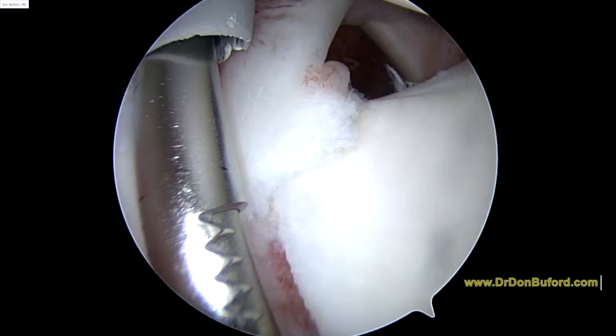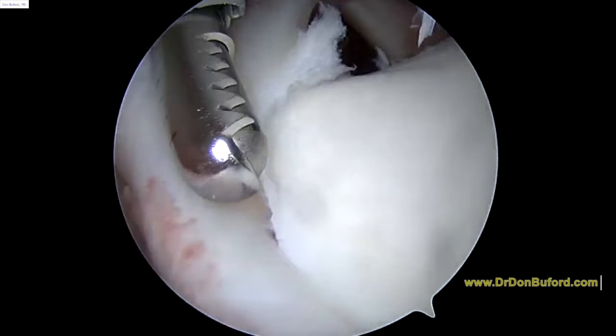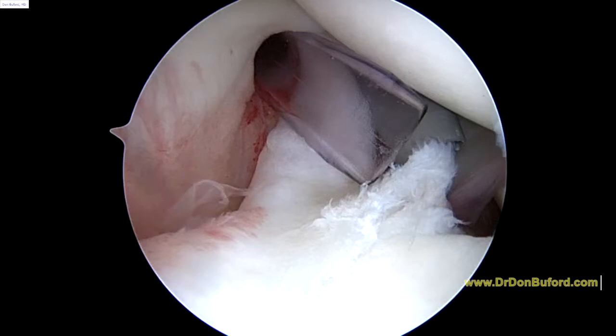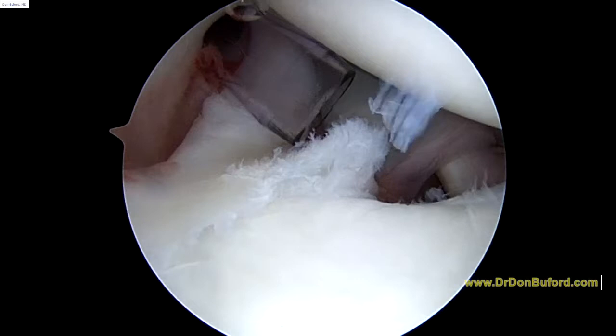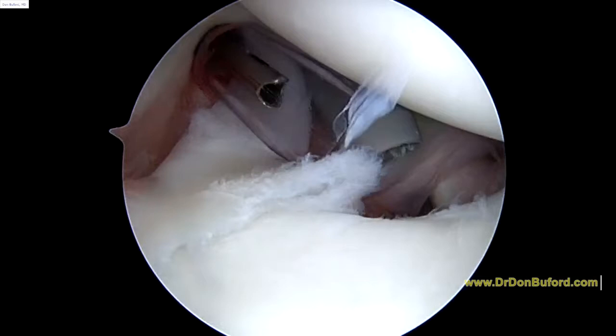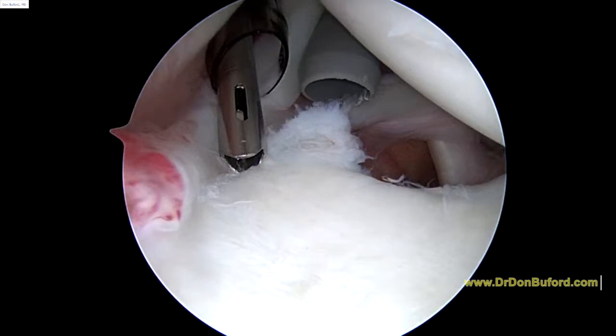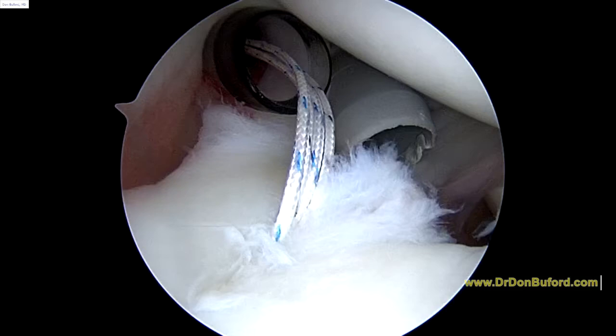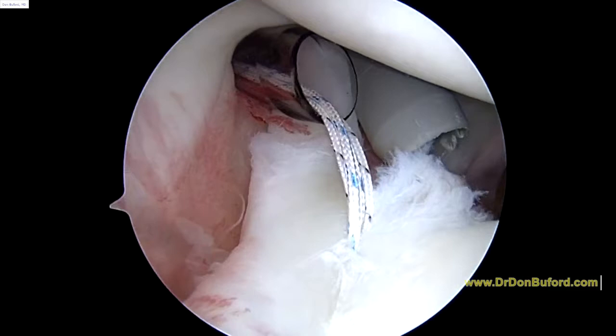I think you just saw it there. So now the next step is to go ahead and place the suture anchor down. In order to do that, we need our guide and we need our drill bit. So we're looking to place our anchor down basically right into that exposed area. So here we've got two sutures coming off the anchor right in front of the biceps.